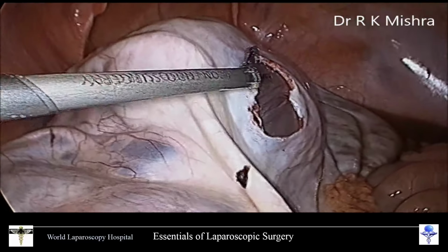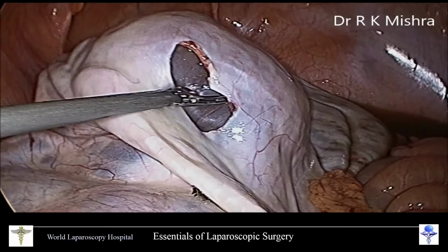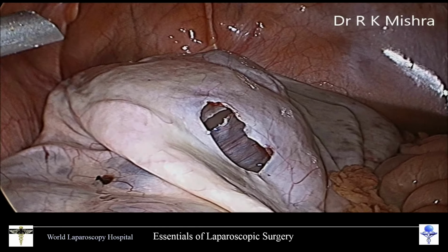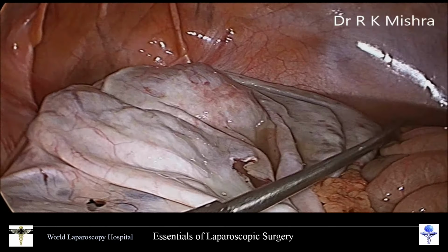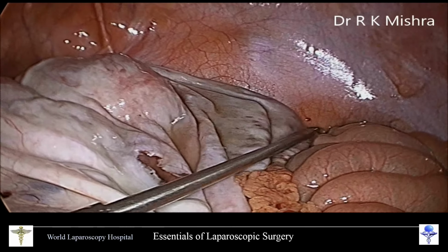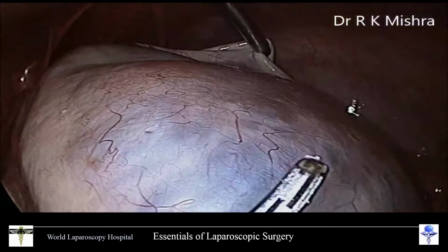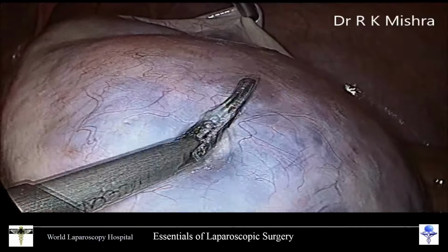You may puncture some more of the compartments if it is multiloculated, so that once the volume is small in the huge cyst, it will be easy for you to manipulate and catch it, otherwise it will not allow you to manipulate it. The small bowel is collapsed because the cyst was keeping it away. This is one other compartment, which you can again puncture and aspirate.